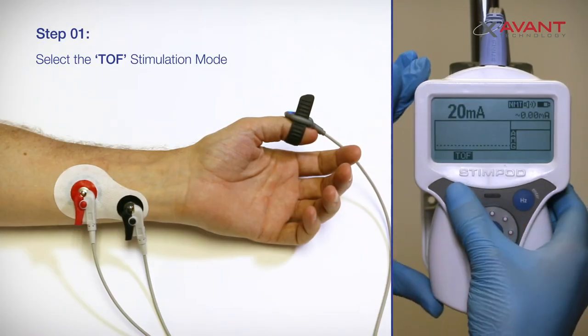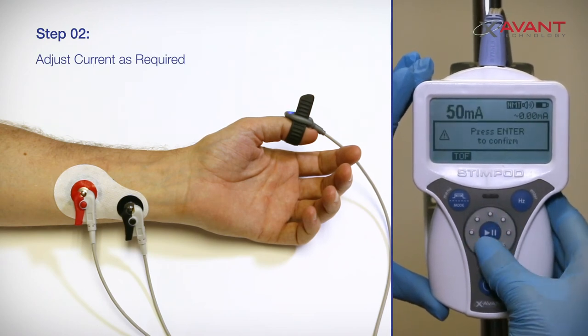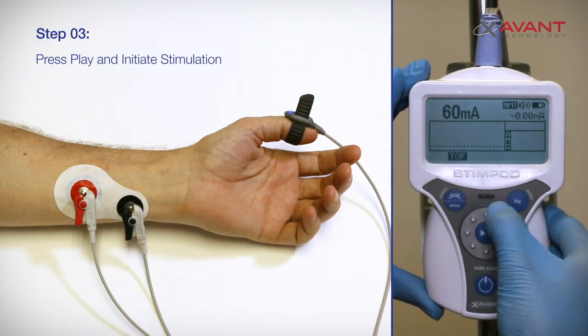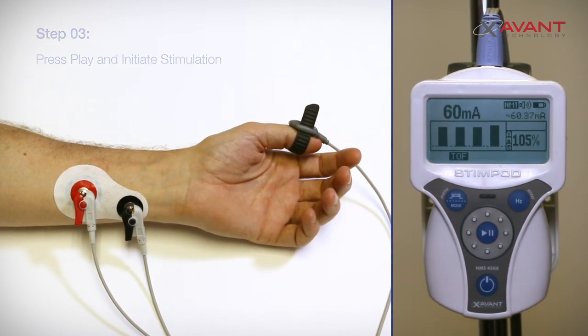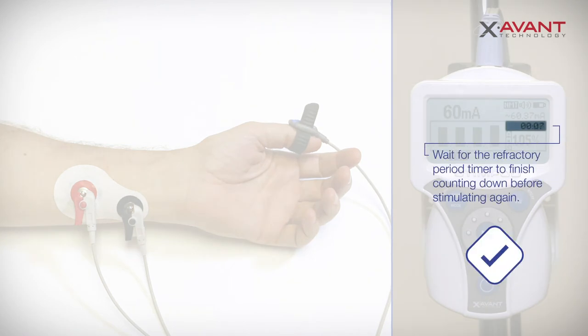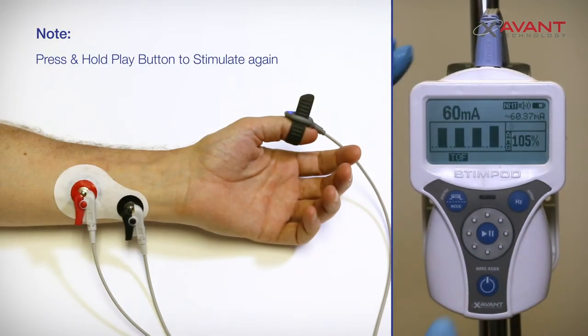Option B: Manual Stimulation. Use the Mode button to select the TOF mode. Manually adjust the current using the adjustment wheel, and press Enter to confirm your choice. Press the Play button to initiate a single TOF sequence. Press and hold the Play button for 2 seconds to initiate a repeat TOF stimulation.